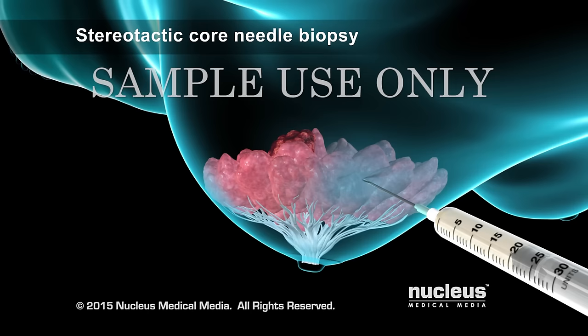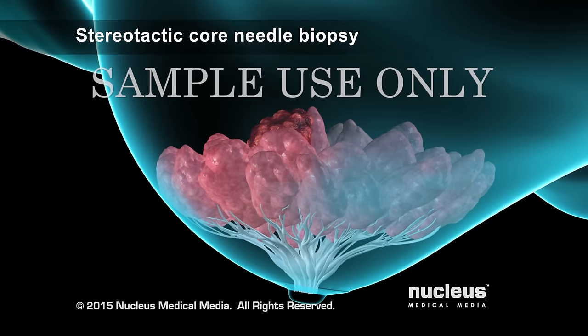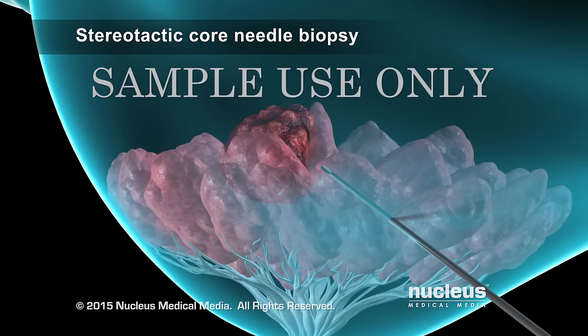Your doctor will inject a local anesthetic to numb the area. Then, using a digital mammogram as a guide, your doctor will insert a hollow needle into the area of concern. Several small cylinders of tissue will be removed for examination.